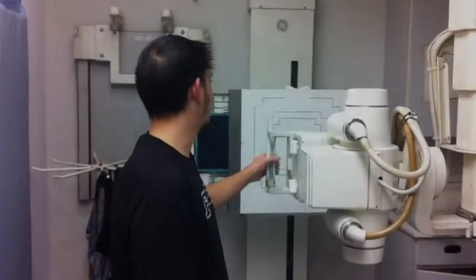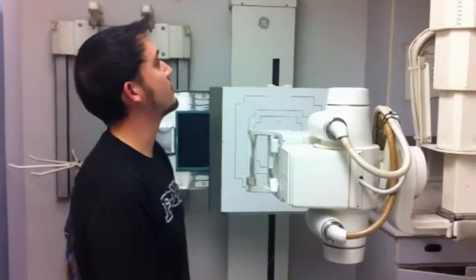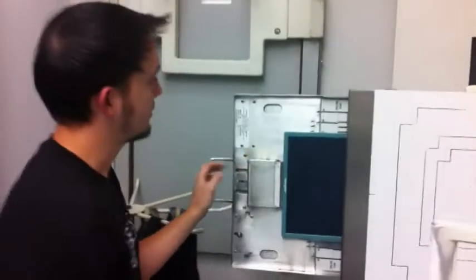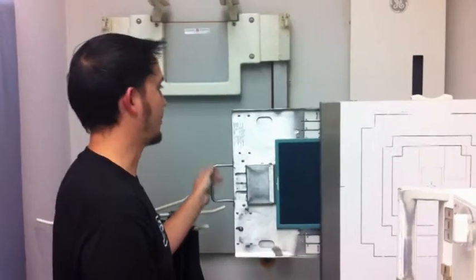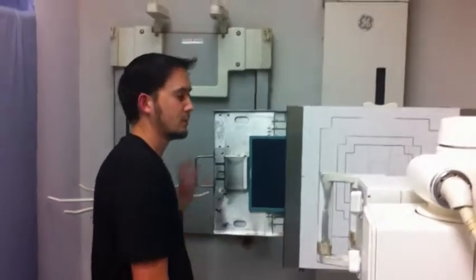So in order to shoot this shoulder, we have to set up our room before we bring in the patient. I have my tube detented along with the wall bucky here. I also have it at 40 inches SID. I also have a 10 by 12 cassette inside the bucky, landscape. Landscape is for the neutral, external, and internal rotation. Then we're going to put it back in the lateral position when we do the scapular Y view.